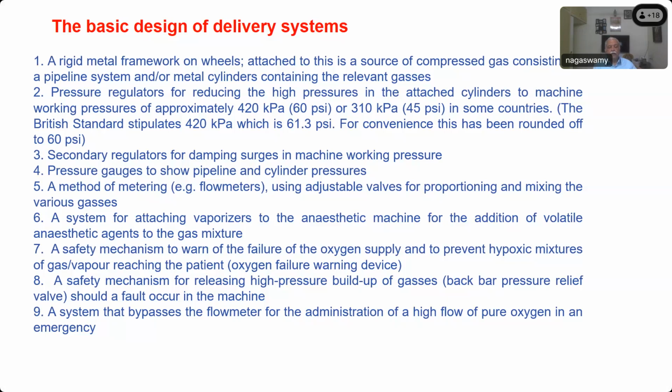It is placed slightly inside from the surface of the machine. Okay. Push button. Okay. What is the most important point you have to say in this question? Decoupling. Supposing 100% oxygen only we want to give, that is why oxygen flush is there.